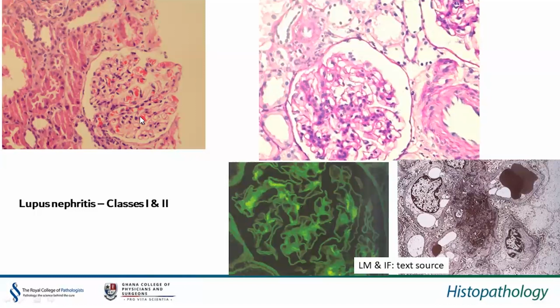The staining that you see in lupus nephritis is characteristically referred to as a full house pattern, in which you get IgG, A, M, C3, and C1q. All of them are present. Note, C1q is present, and the intensity of IgG staining is higher than for all the others. These are some features that you have to remember.